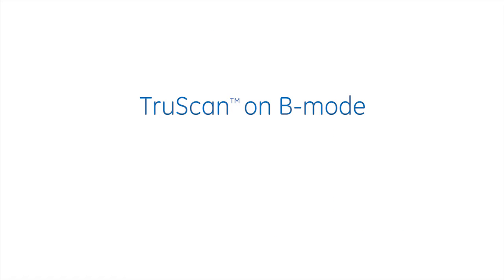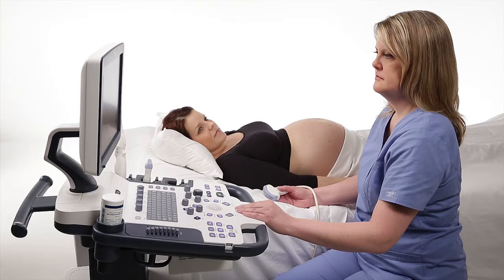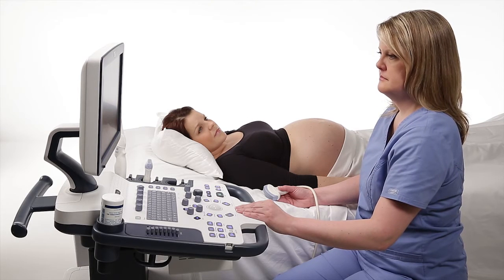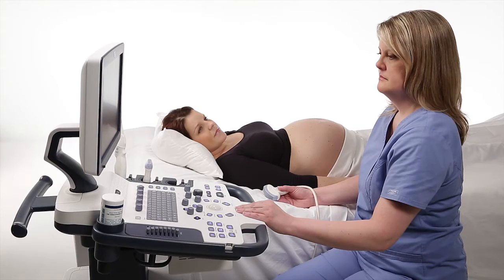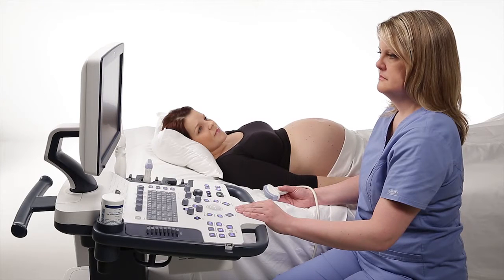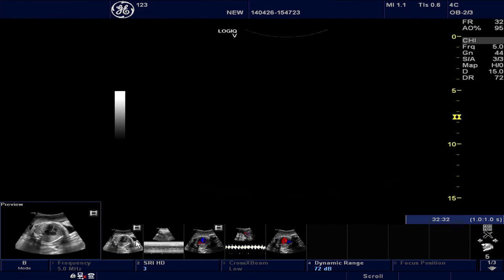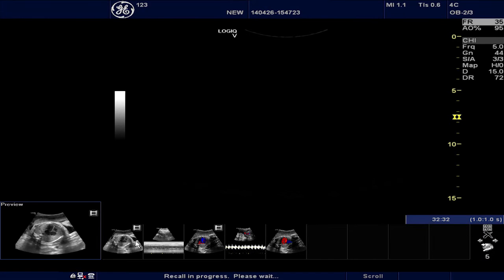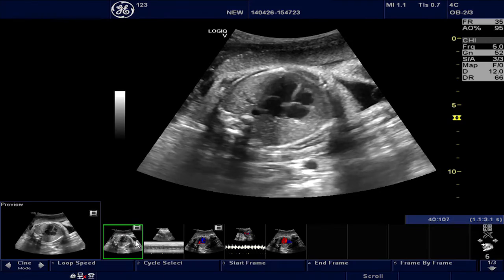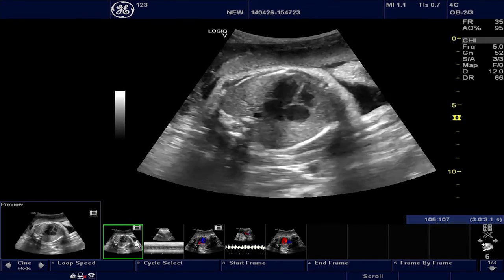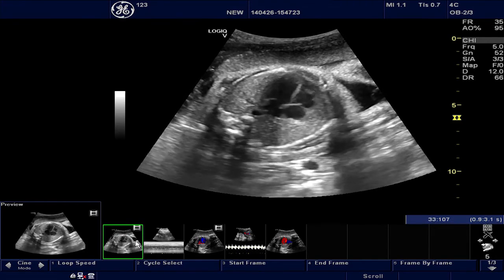TrueScan on B-Mode: We'll begin with recalling a B-Mode raw data image. Let me use this image of a Fetal Heart 4 Chamber View to show how you can apply various post-processing tools to your image.